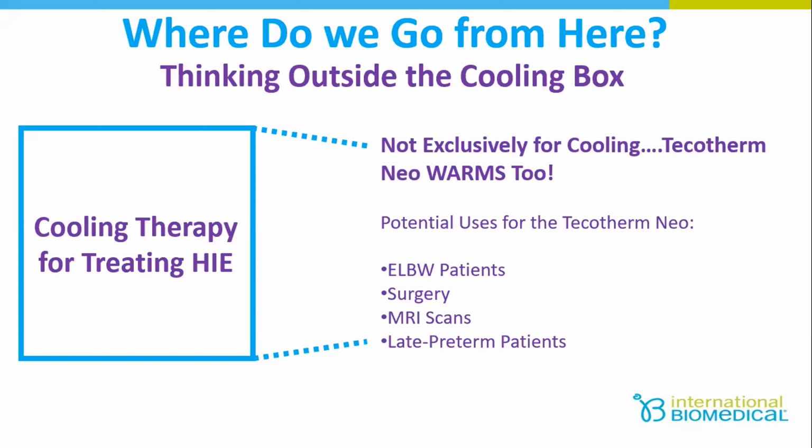And who were the patients that we're having a hard time with? And were they coming in warm or coming in cool? Well, the majority of the ones that are coming in out of our range are coming just under 36.5. And the kids, when we actually look at them, they're actually our late preterms. They're our smaller kids. And it harkened back to the fact that we're in our isolette and we don't have a servo-controlled way to adjust air temp. And our patients are being transported between different types of environments.